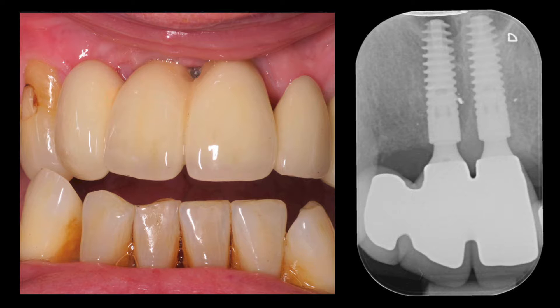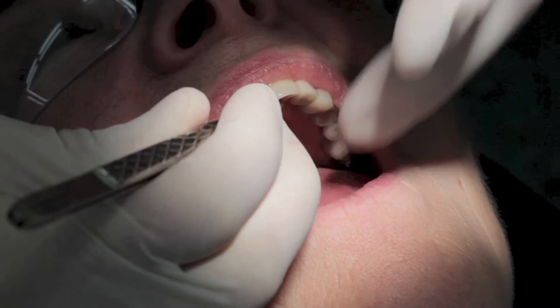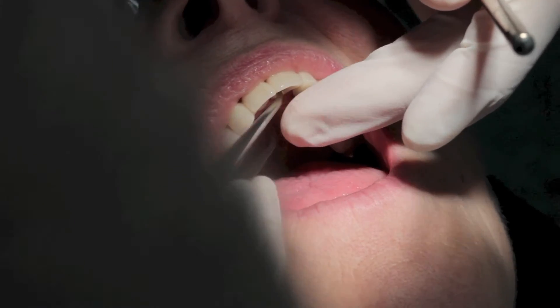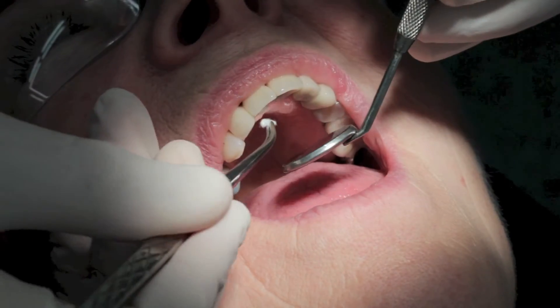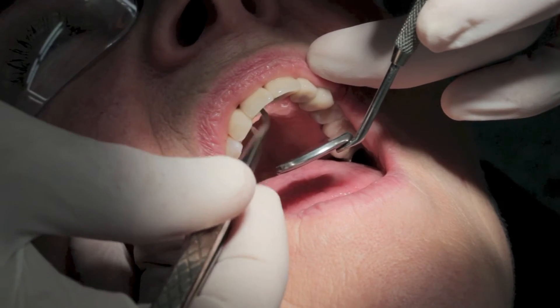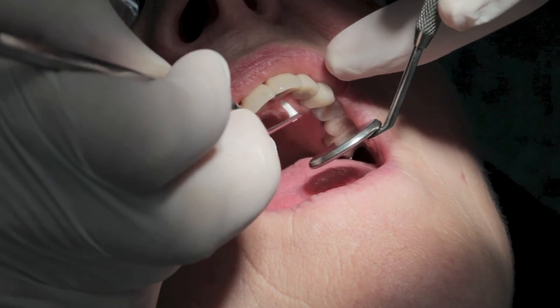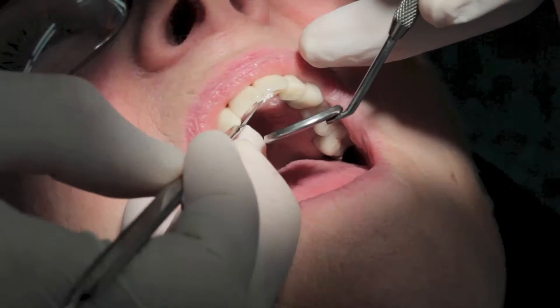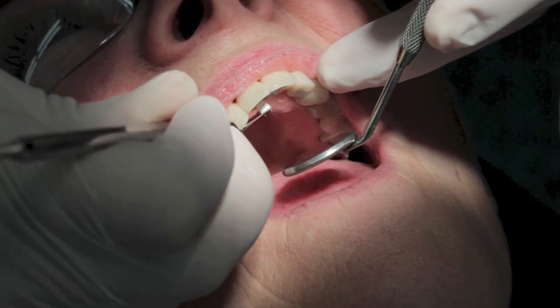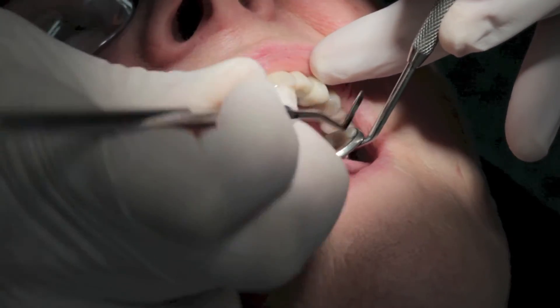Now that we've checked the bridge fit with the X-ray just taken and all looked well, I'm going to fill the screw access holes initially with a cotton wool pledget to cover the screw head, followed by some temporary filling material. At our one-month review this is easily removed and we can check the screws to ensure all is well, and it can then be changed for a more robust composite material.